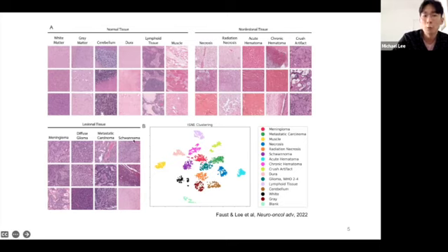We would also, of course, have lesional tissue, or essentially tumors, the different types of tumors. We mainly wanted to focus on brain tumors, the 4 most common brain tumors in neuropathology cases, namely meningioma, glioma, metastatic tumors, as well as schwannoma. Using these 15 or 16 classes, we would train our histomorphologic classifier to be able to identify the different features that are in the H&E stained whole slide images.